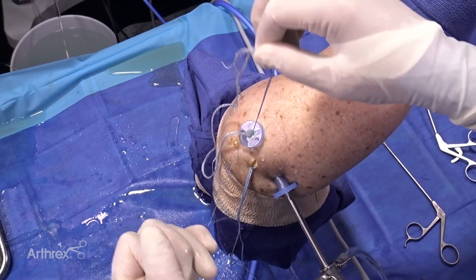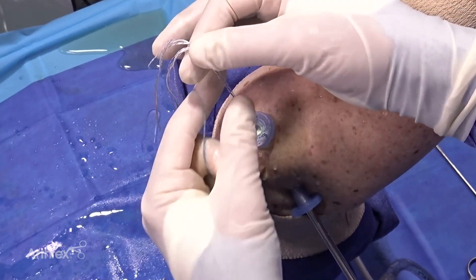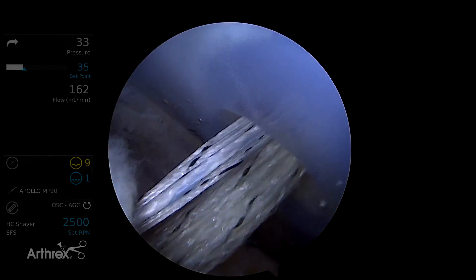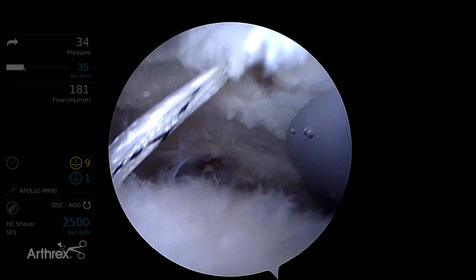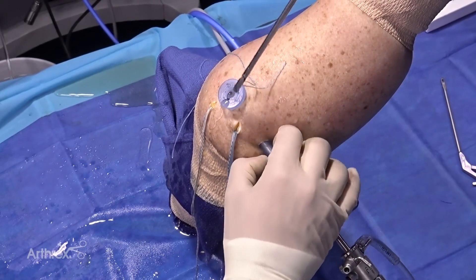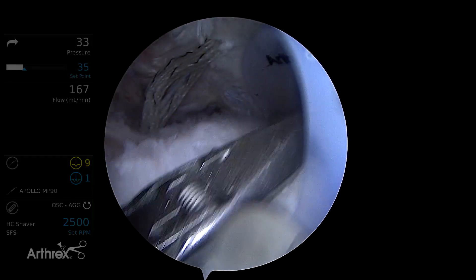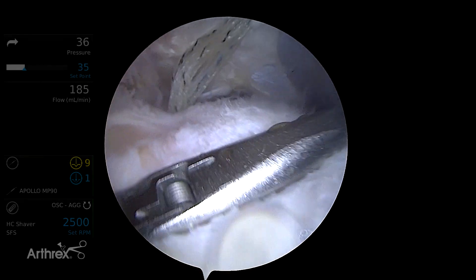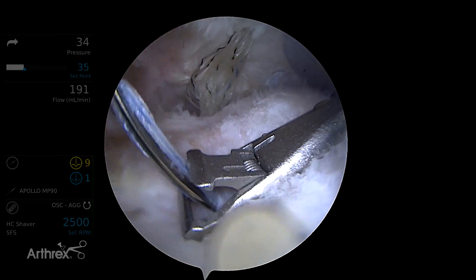You can watch these pass through. Always turn these back on themselves within the loop of the fiber link so that you won't pull that loop down to the base of the anchor and actually foul your sutures as you go through. Then I like to pull all the slack out. Now we're going to pass this suture tape fiber link for the posteromedial anchor sutures and place that right about two millimeters lateral to the muscle-tendon junction.